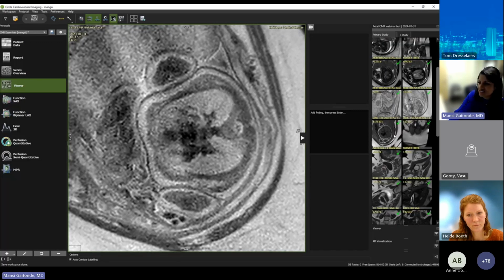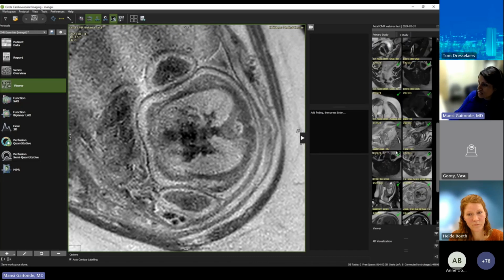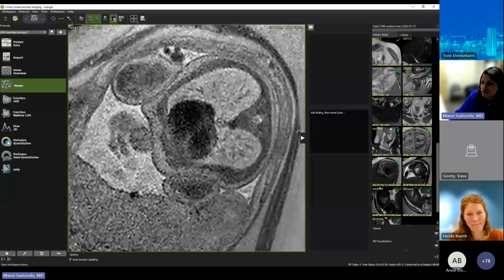So we took a pause, took some deep breaths, and spent some time looking at the placenta a bit. So we took a little bit of a break. And our conclusion at that was that the placenta accreta was not clinically significant. And so I felt like we got very good images from that regard.